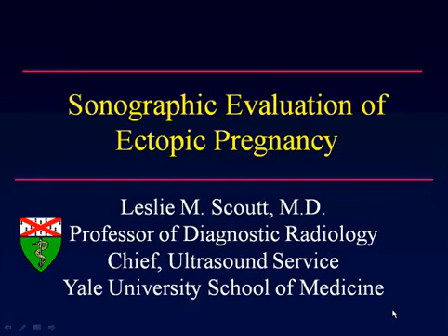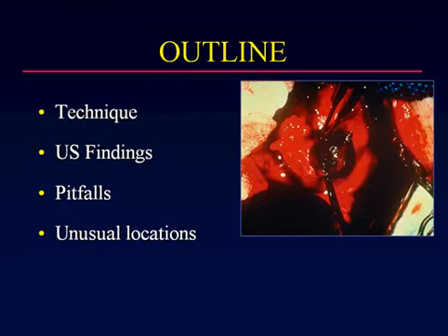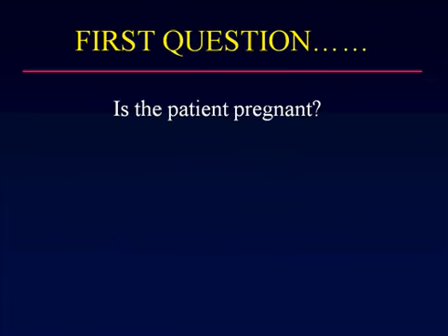Hello, we are going to be talking about the sonographic evaluation of ectopic pregnancy in the next 30 to 45 minutes. The outline and objectives of this presentation are to discuss the ultrasound technique for the evaluation of ectopic pregnancy, to review the ultrasound findings, and discuss common pitfalls as well as unusual locations for ectopic pregnancies.